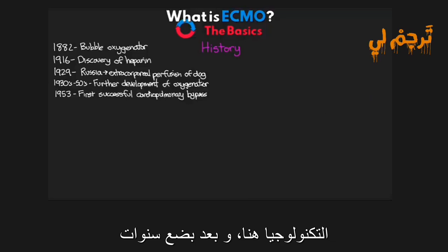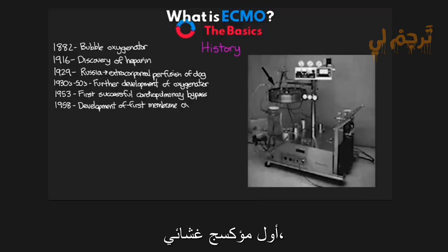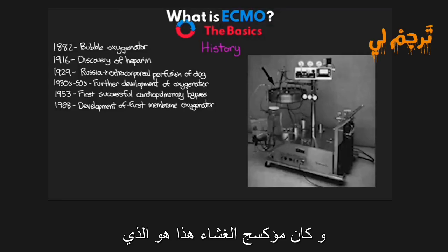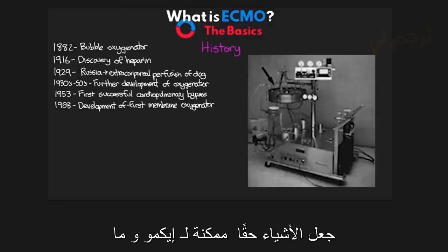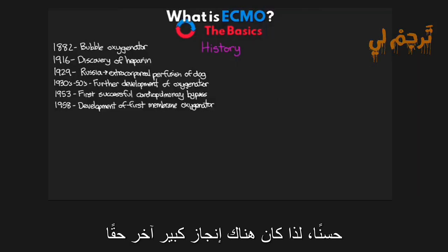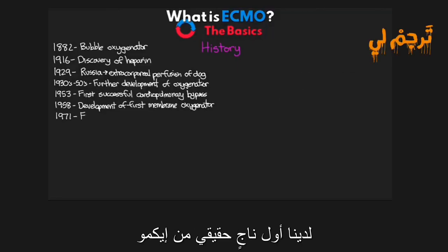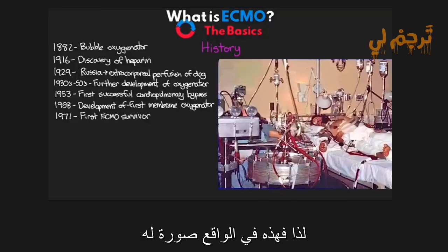A few years later, in 1958, they had the development of the first membrane oxygenator. It was this membrane oxygenator that really made things possible for ECMO and is still carried on in the technology that we use today. All right, so another really big milestone for ECMO was in 1971. We had the first true ECMO survivor. So this is actually a picture of him here.